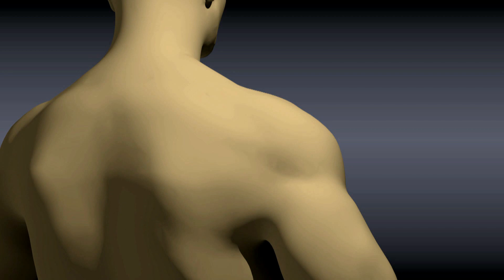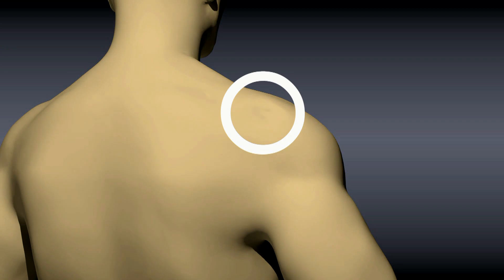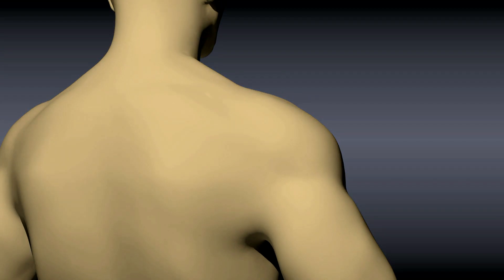The acromion can be felt by pressing on the shoulder. The space just below the acromion is felt and marked. This will be the injection site.